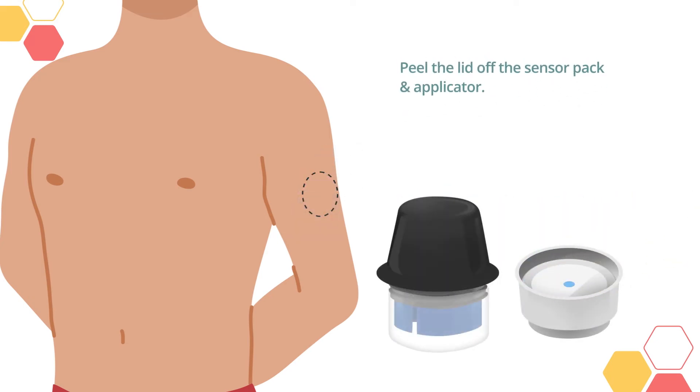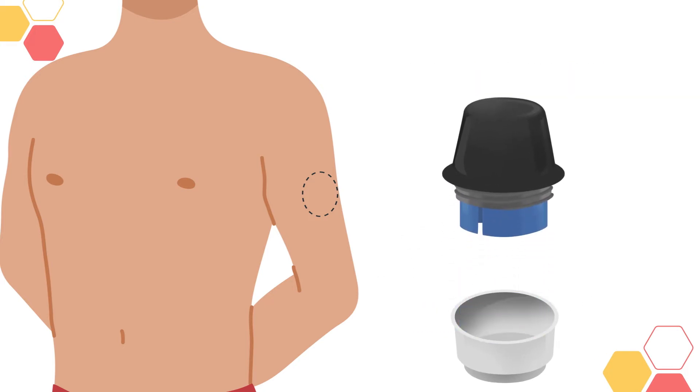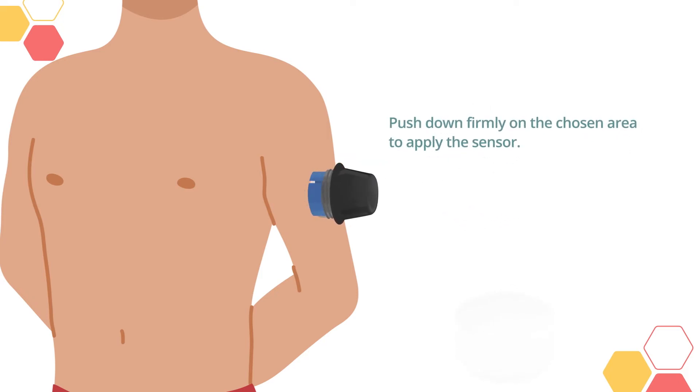Peel the lid off the sensor pack and applicator. Align the sensor pack and applicator and press firmly. Then lift the sensor out. Push down firmly on the chosen area to apply the sensor.